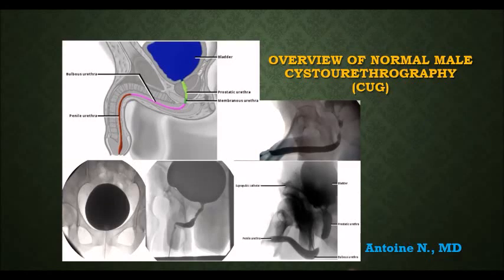Welcome to this short presentation, an overview of cystourethrography.